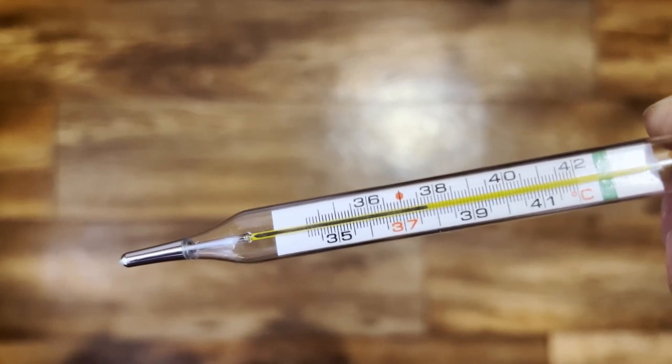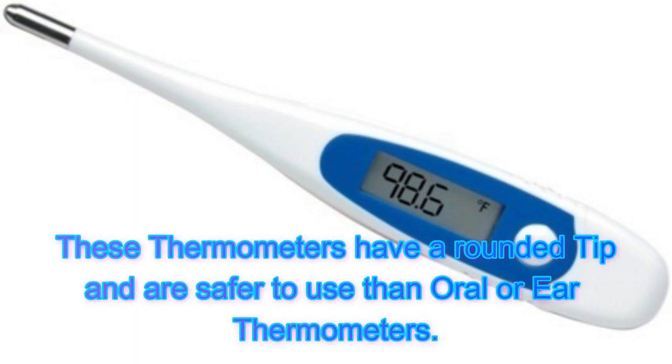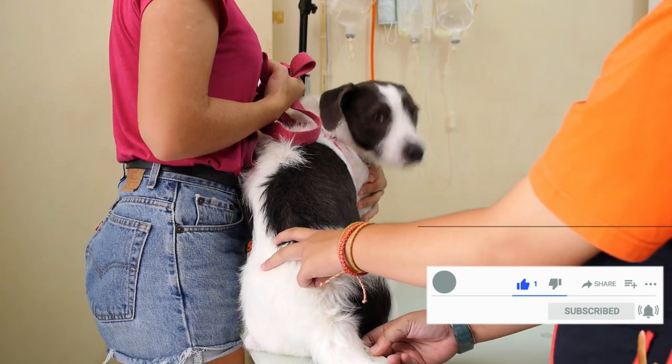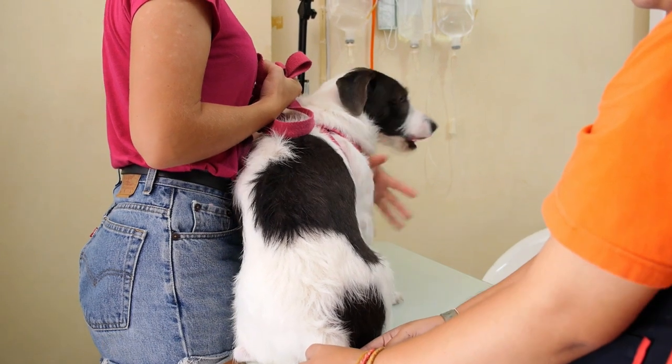Choose the right thermometer. Look for a rectal thermometer designed for pets. These thermometers have a rounded tip and are safer to use than oral or ear thermometers. Prepare and handle your dog. Make sure your dog is calm and comfortable before attempting to take their temperature. Have someone hold and soothe them if needed.